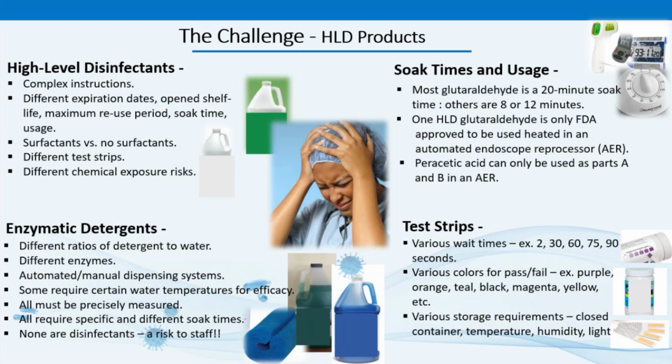Adding to the already challenging HLD process is a lack of standardization among HLD products. High-level disinfectants have complex instructions, different expiration dates, open shelf life, maximum reuse period, soak time, and usage. There can be product issues with single-use HLDs that may not fully achieve their MEC, and reusable HLDs that might fail before their maximum usage period. Some disinfectants have different test strips, different chemical exposure risks, and issues with material compatibility. Enzymatic detergents have different ratios of detergent to water, and there are many automated dispensing systems.